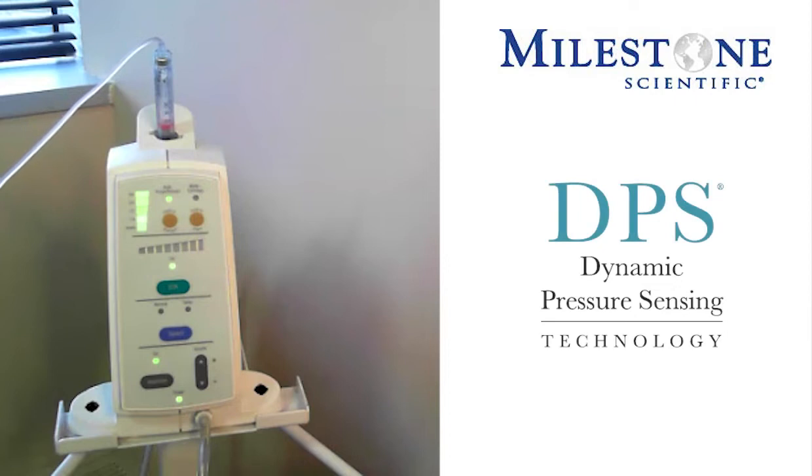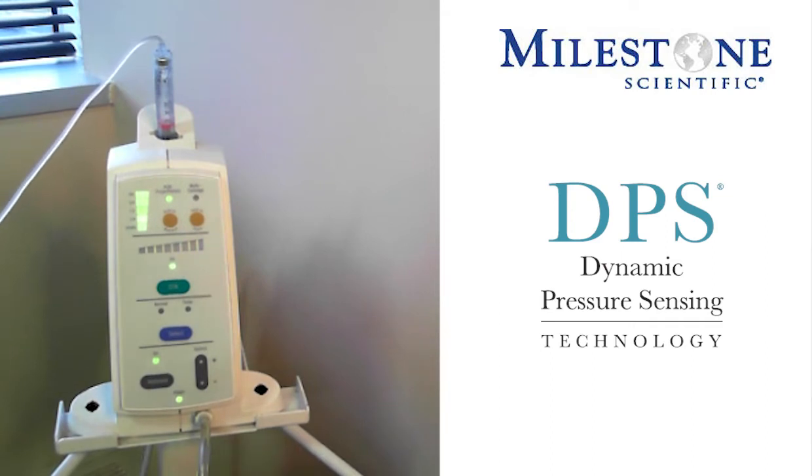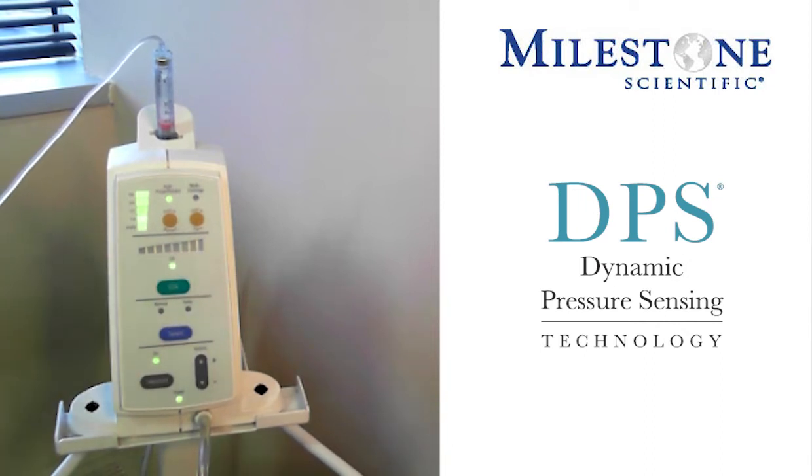The instrument itself has dynamic pressure sensing, or DPS. Dynamic pressure sensing works in conjunction with the single tooth injection, and this horizontal scale represents that DPS. If and when you are doing that single tooth injection and your needle placement is correct, you will begin to see that scale light up for you. This scale during the single tooth injection also becomes a measure of pressure — the more lights you get lit up, the more pressure you have within the area of the sulcus.